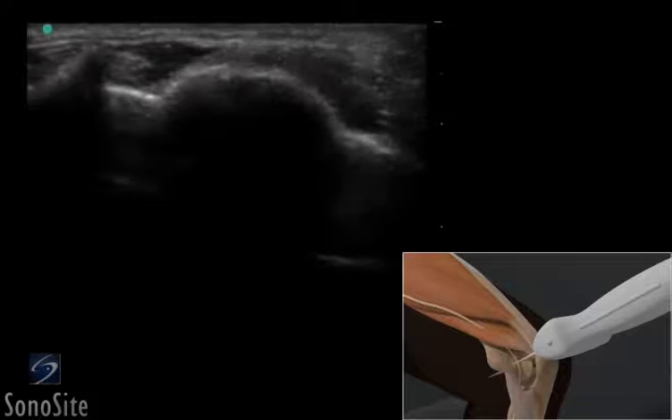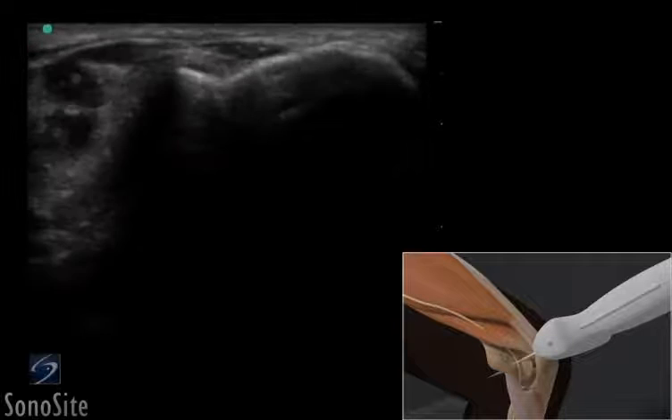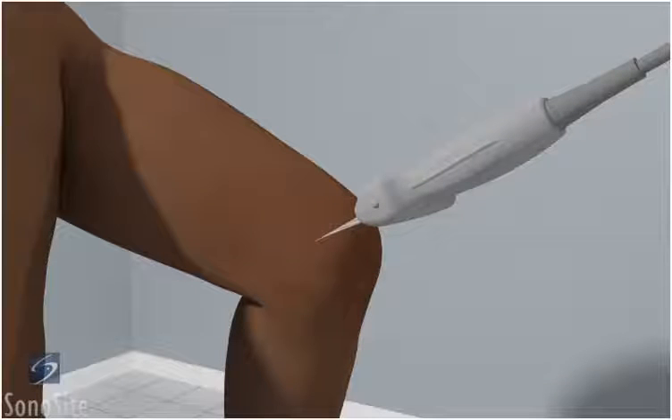A linear array transducer with a musculoskeletal exam type is used to perform an ultrasound examination of the ulnar nerve. The patient is asked to flex their elbow slightly with the hand placed on the examination table and the forearm in forced internal rotation.